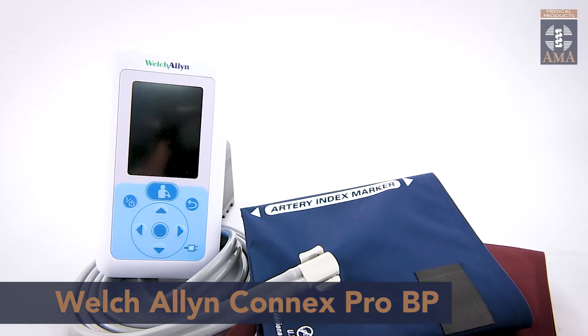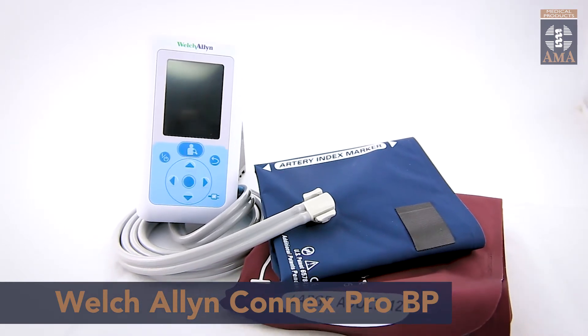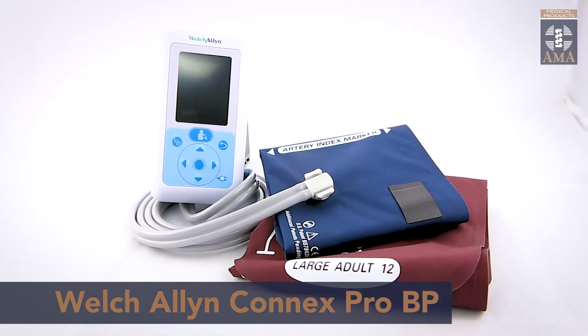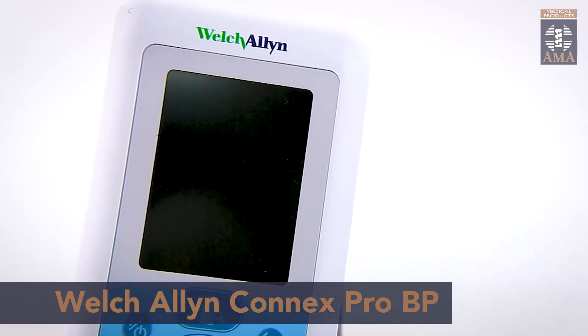The Welch Allyn Connex 3400 Pro BP is a digital and automatic blood pressure monitor with patented SureBP technology. Portable, accurate and reliable, the Welch Allyn Connex 3400 is a hospital-grade automatic blood pressure solution that fits into the palm of your hand. It can be used in every clinical environment and remotely while on the move or in the field, making you an expert at blood pressure measurement.